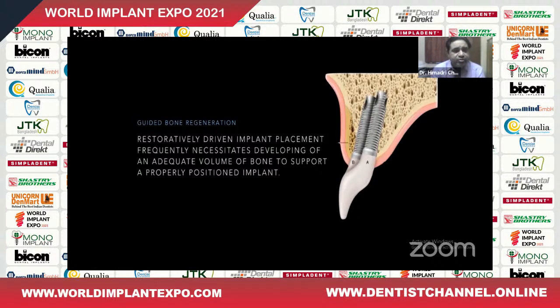And that's why GBR is so important, because in the last 30, 40 years, we have been able to understand that placing the implant in native bone doesn't always give you the best outcome. So we understand that placing the implant in the right prosthetic position is more important than placing the implant in just any bone. That is very important. And with the predictable techniques of GBR that have been evaluated in the last 25, 30 years, now we are in a position to place implants and to build bone around them. So that's the whole essence of my discussion today.